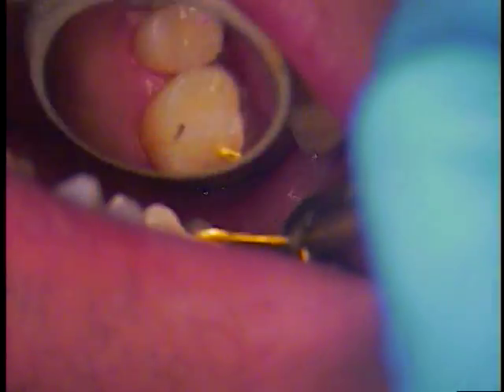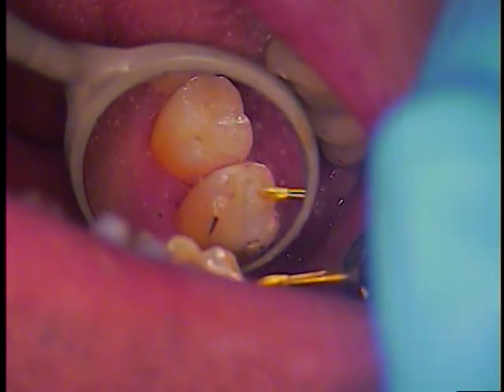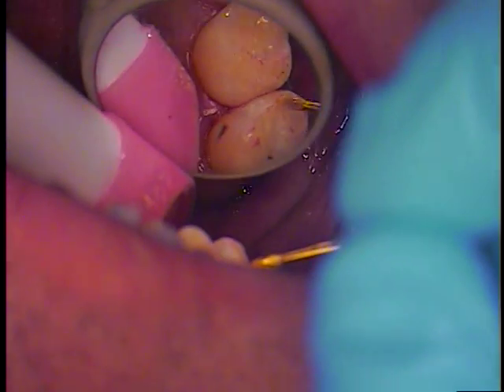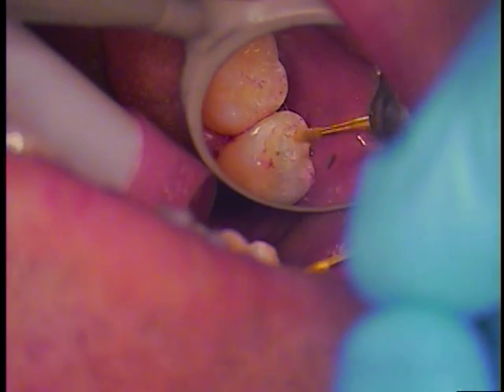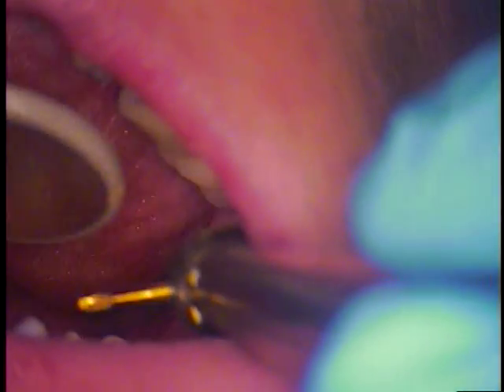Tap tap tap again. I always mention that if you're hitting even on this side, it should be as even on the other. I've got my mirror - he's dry. Tap tap tap tap. That's an incline, so what I want to do is adjust the lower a little bit. Might have a lower functional cusp that's out too far.